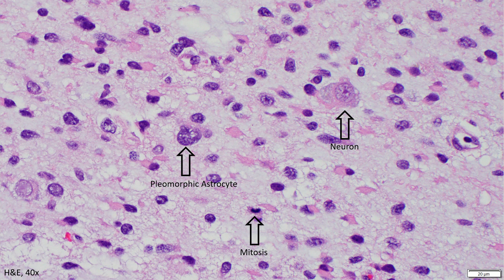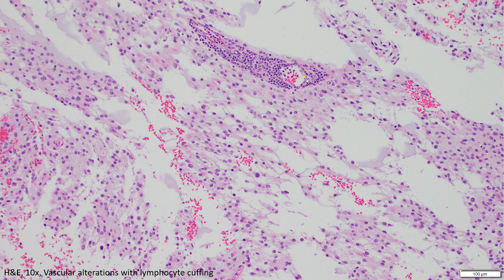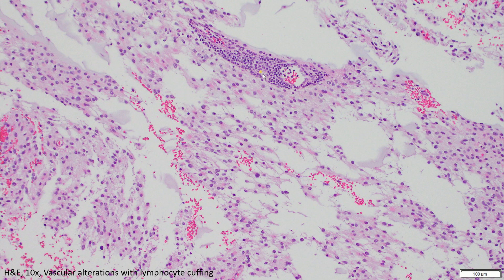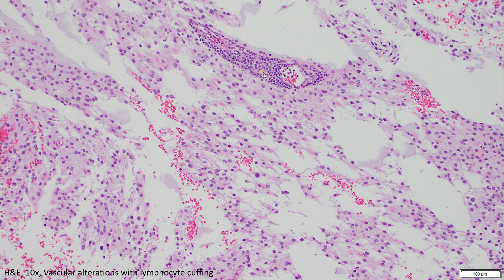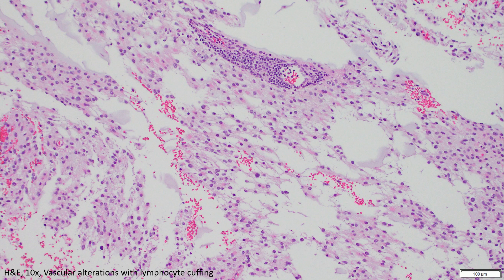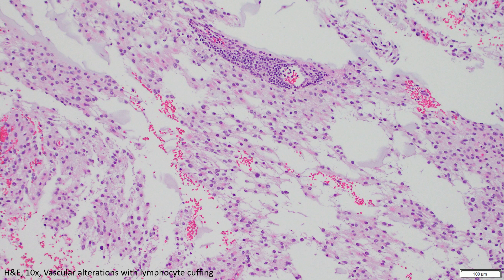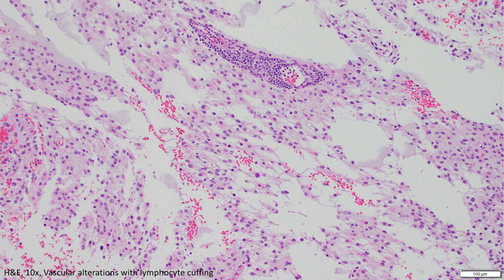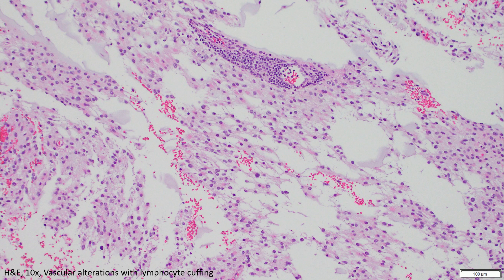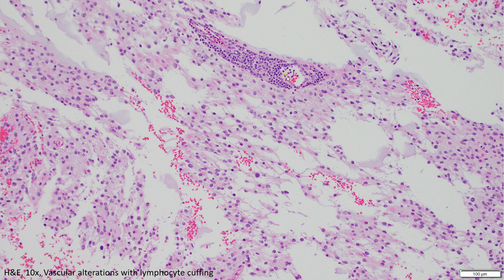There are some vascular alterations here — specifically lymphocytic cuffing, in which lymphocytes form a little cuff around the vessels. This does not qualify as the vascular proliferation you would see in a glioblastoma. Glioblastomas are characterized by a diffuse astrocytoma that has vascular proliferation with endothelial cell hypertrophy and hyperplasia, where the endothelial cells are piled on top of each other. Here we don't see that — we only see lymphocytic cuffing.